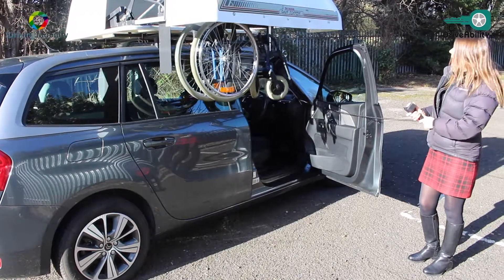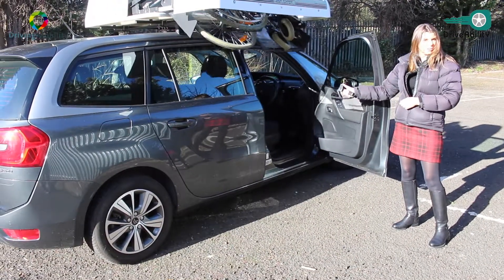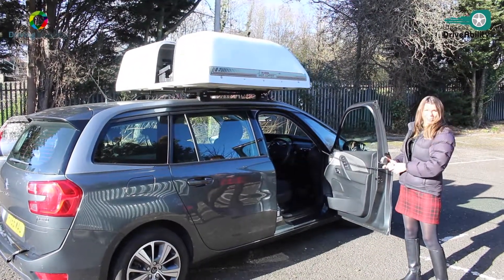So the wheelchair user can be in the car while this is happening. This can be done even inside if it's raining — you can do it inside with your door shut. So the piece of equipment sort of attaches to the car there.